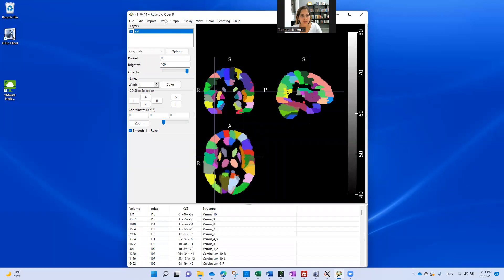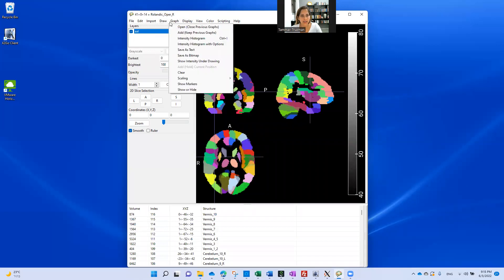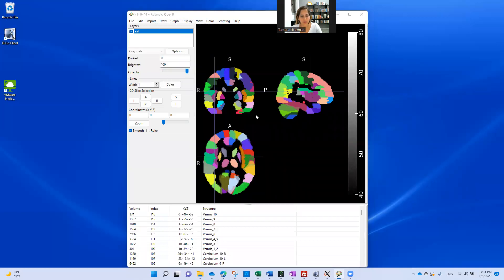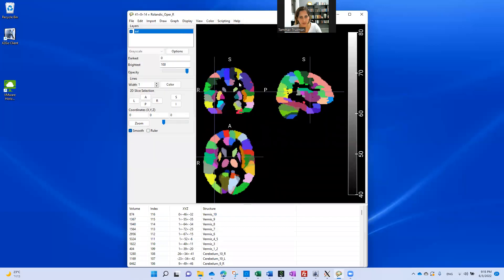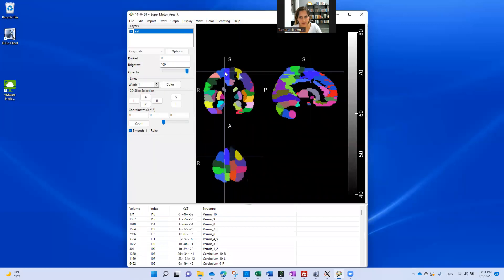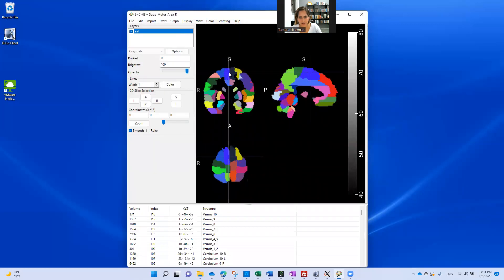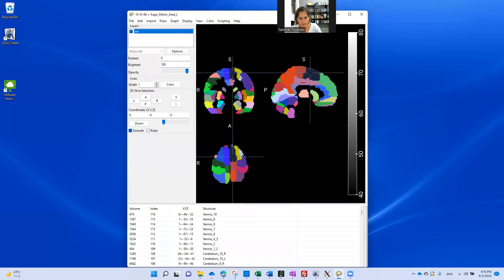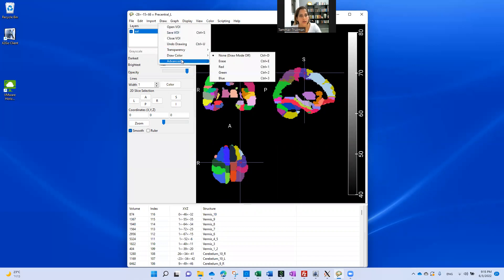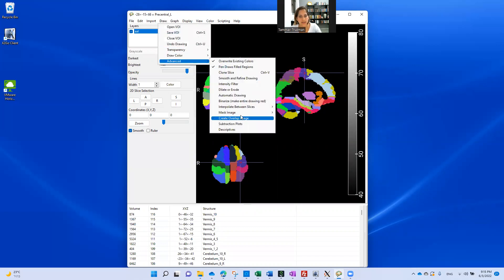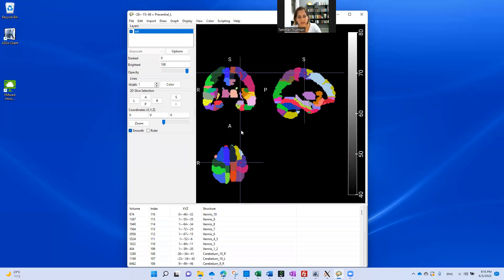Now I add my VOI. Let's add the same VOI as before. This was my subject. It's hard to see because of the colors. I guess here it is. You can see the red overlaid on the purple color. And now I go to draw, advanced, descriptives.